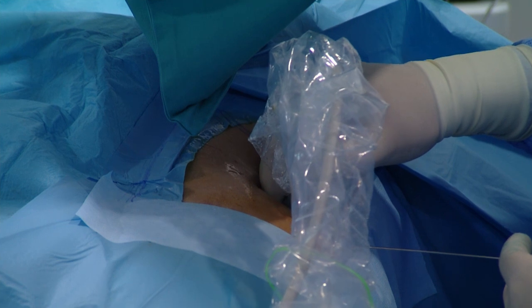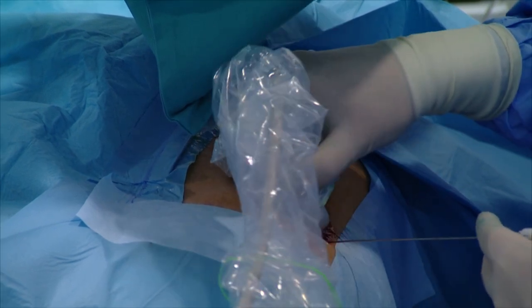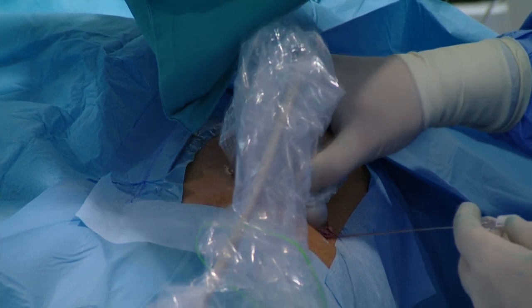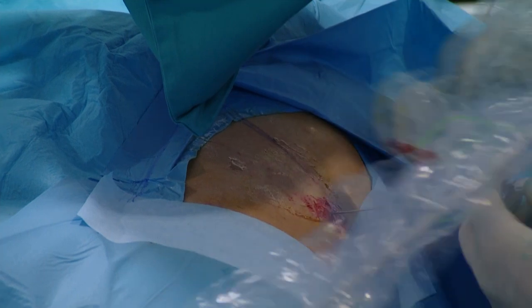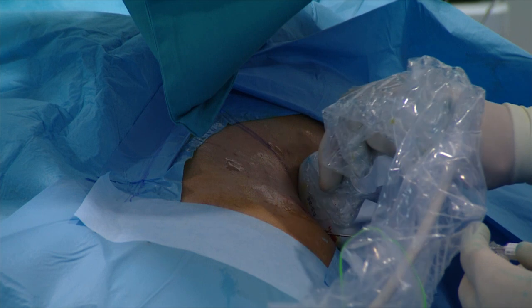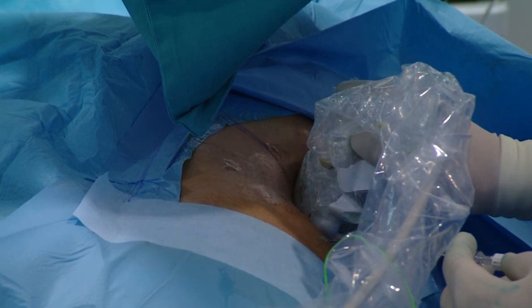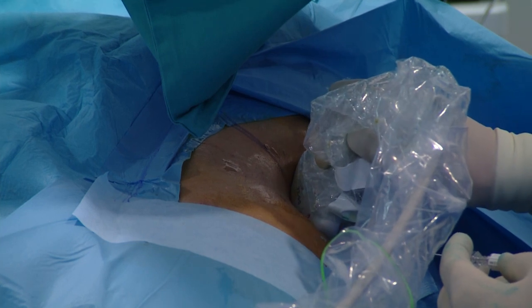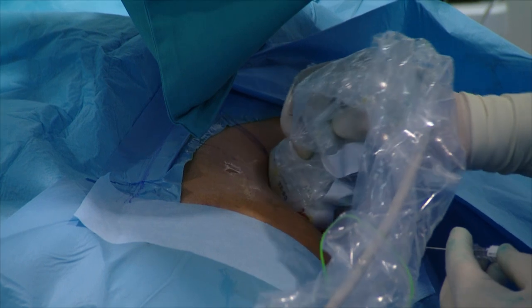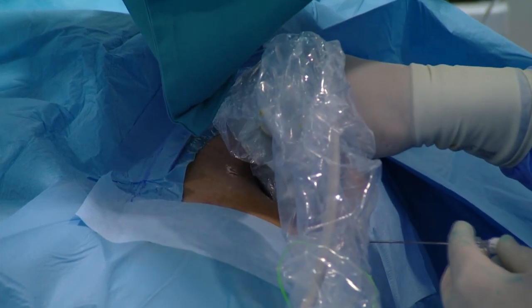This is our stone. Yes, we see it clearly. Now I have the difficulty that there is no guidance system, but I think we will be successful. With freehand puncture, you will be aiming at the stone directly. We first should see the tip of the needle, otherwise we are not successful.